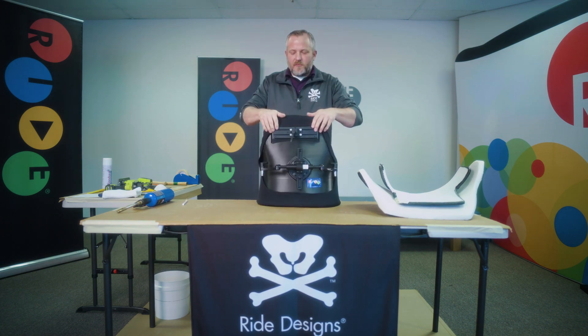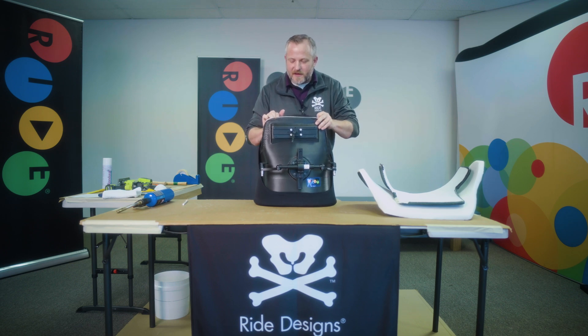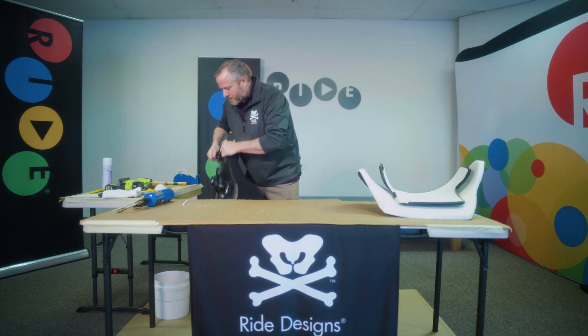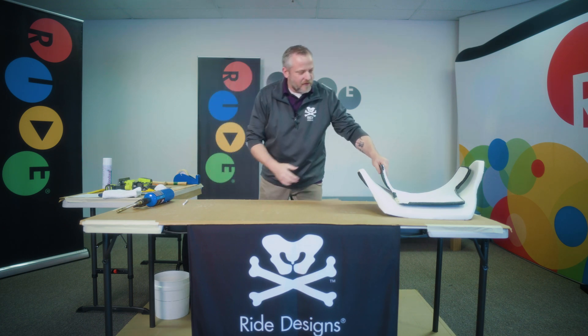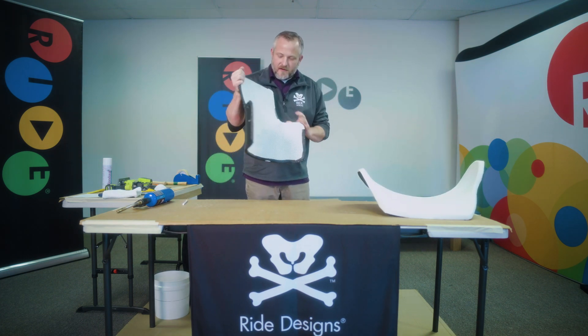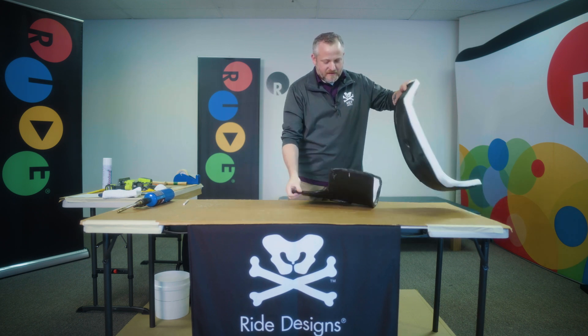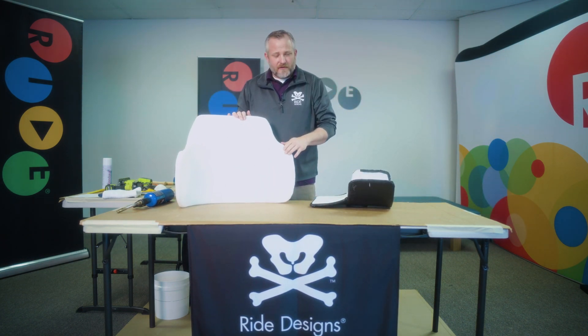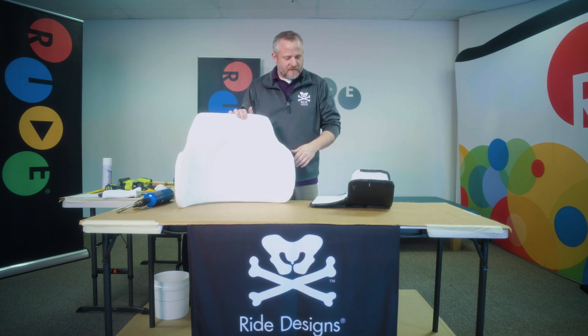First, we're going to remove this cover. I'm just going to peel that back out of the way — it's just a shower cap style cover. Peel that off and then you're left with either a mesh liner or our Accusoft liner, whichever you've ordered. You have two liner options and both modifications are very similar.